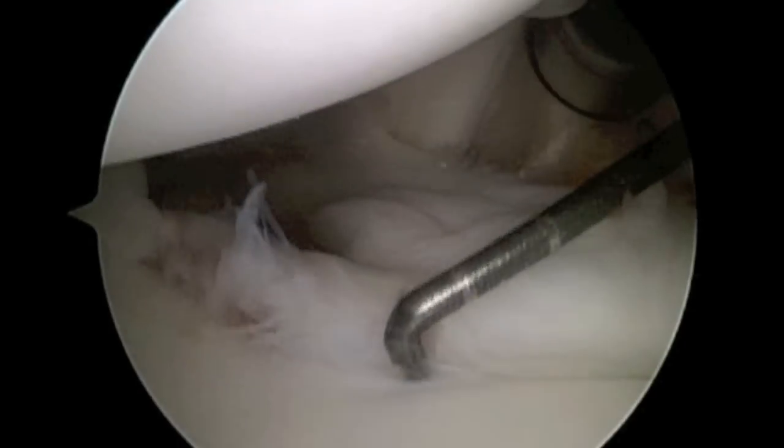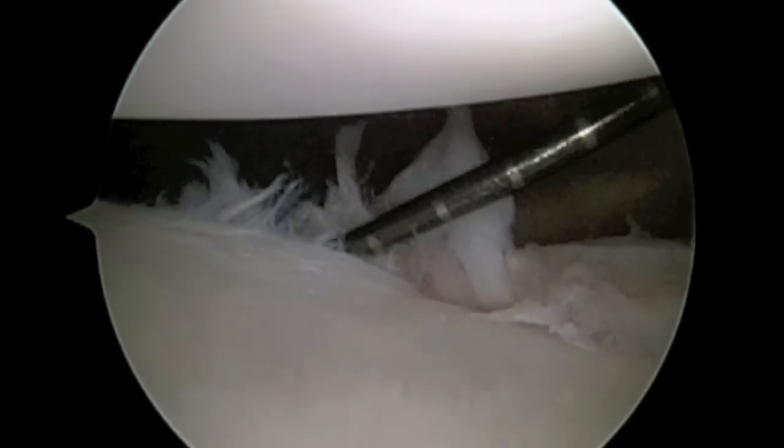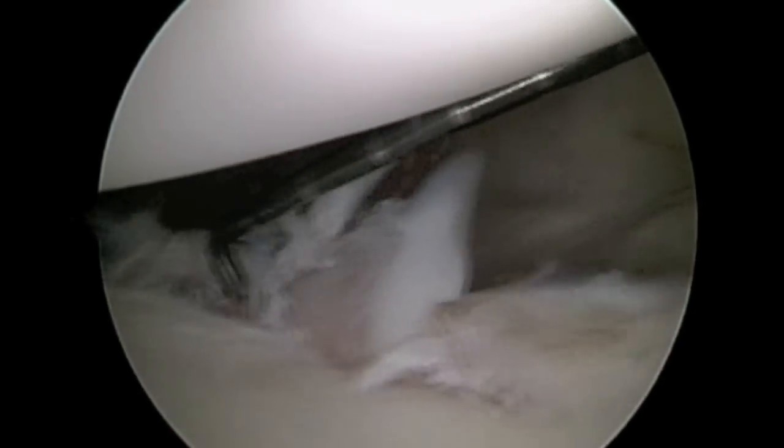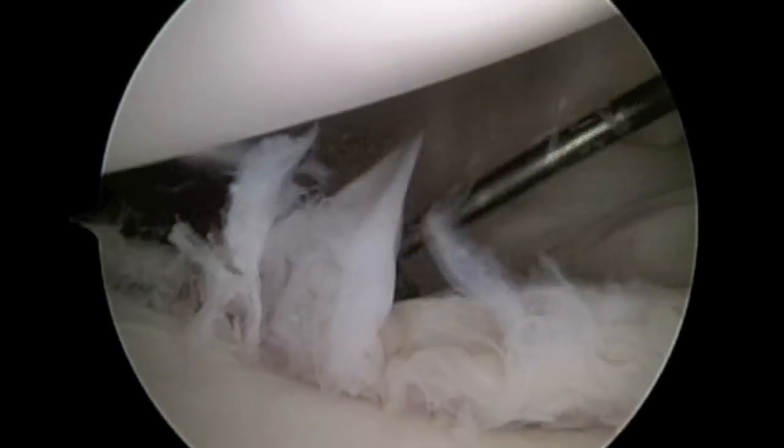This is a view of a right shoulder with a Bankart lesion. A Bankart lesion is a tear of the labrum in the front of the shoulder toward the bottom of the socket. The socket is on the bottom of the video and the humeral head or ball is on the top portion. We can see that the labrum is quite frayed due to multiple dislocations.